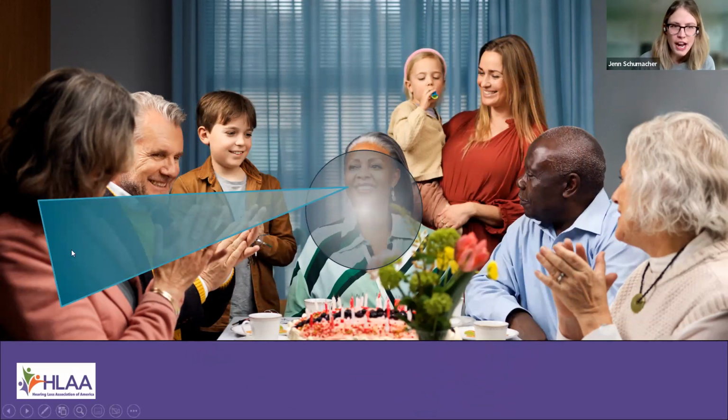You can see my little triangle here. It's like a little laser pointer. So if we imagine that our birthday girl here is wanting to understand this friend on the left in the peach jacket, the hearing aid can use those directional microphones to cut out any sound going on behind her and really just focus on the one person. So that's super helpful in terms of understanding one person.